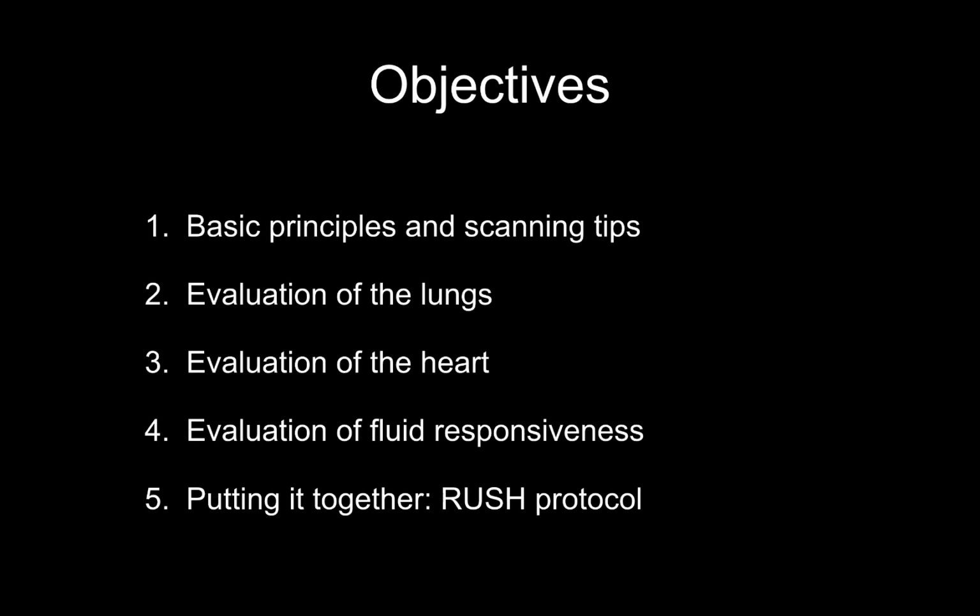This online capsule will be divided into 5 sections. First of all, we're going to go over some basic principles and tips to get good images. Then we'll sequentially go over evaluation of the lungs, the heart, and fluid responsiveness, which will focus on IVC. And finally, we'll put it all together as part of the RUSH protocol, which is a systematic approach to evaluating a patient in shock with bedside ultrasound.